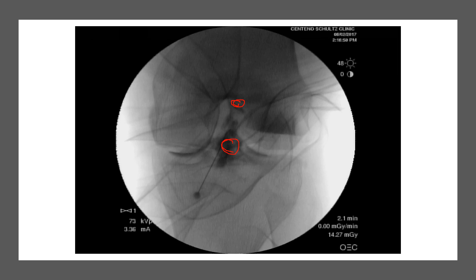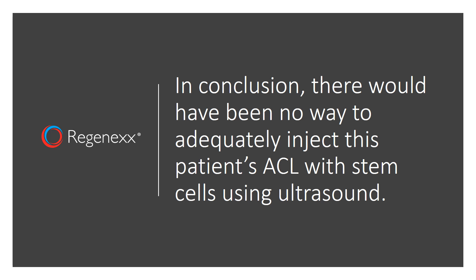The concept that you could get anything approaching this coverage coming from the front, getting the tibial insertion, or coming from the back to get the origin of the ACL — it's just not tenable at all. In conclusion, there's no way to adequately inject this patient's ACL with stem cells under ultrasound. You'll get some stem cells into the ACL, but you're not going to get stem cells to cover the entire ligament. Thanks so much for watching, and have a great day.